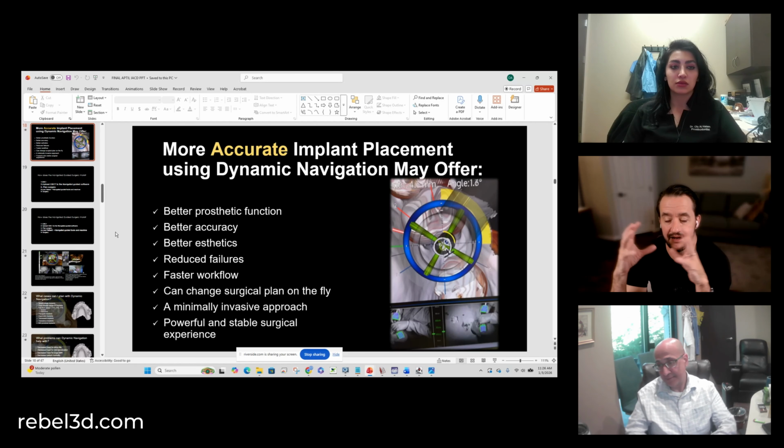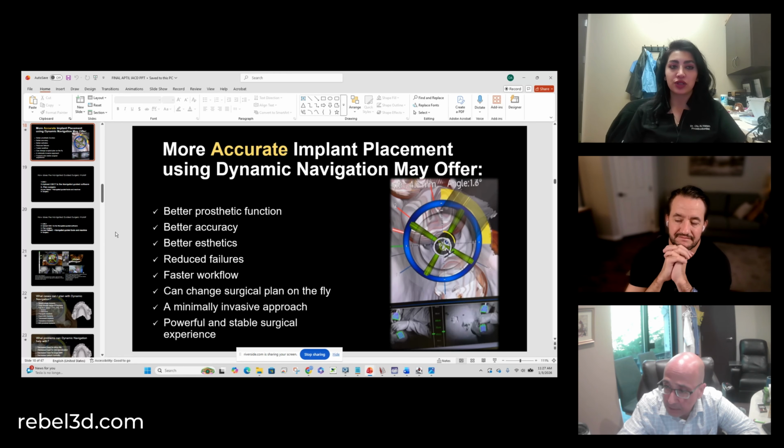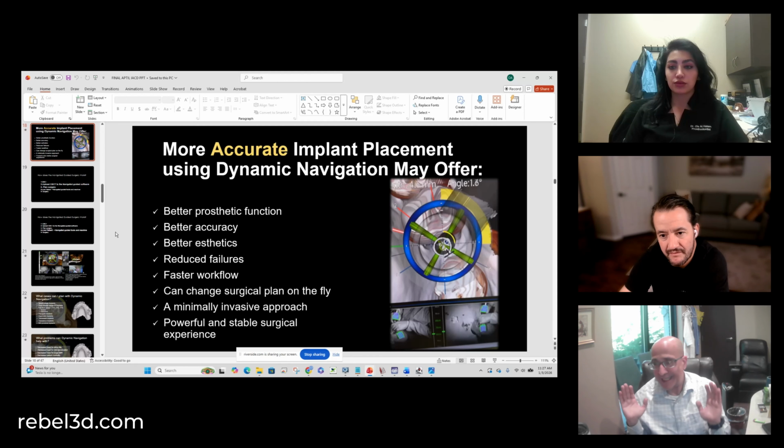And how accurate is the bite with this first provisional? Pretty accurate. With this technique, I would say 95, 98% accurate. Wow. So the rest of it, you can just adjust, scan it, and then deliver another set if you want. So you're getting very, very close occlusion on prototype 1, because you're using the CBCT. You're relying on that for your bite, not on the intraoral scanner. This kind of merging the files is the key.